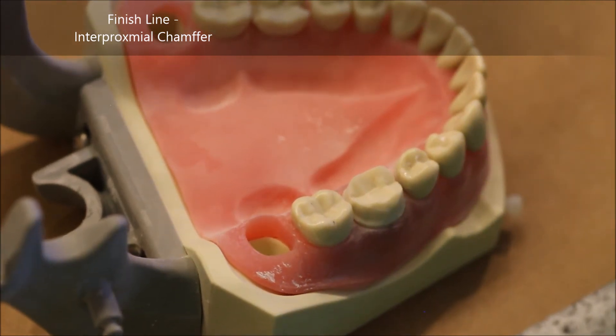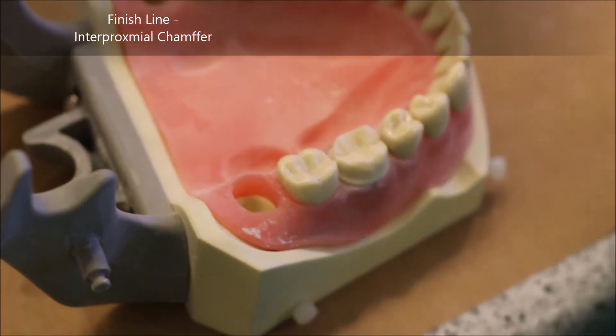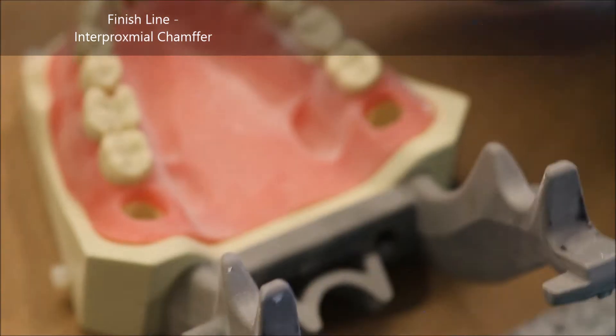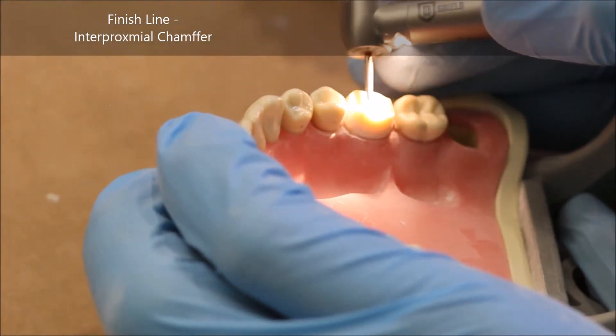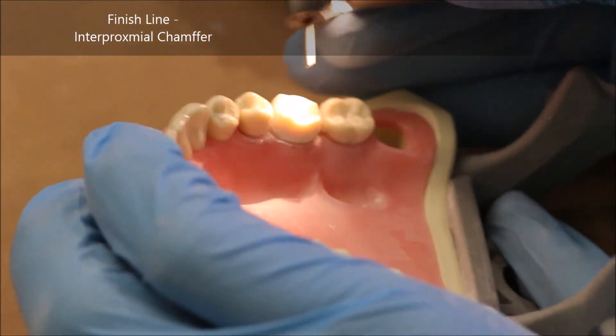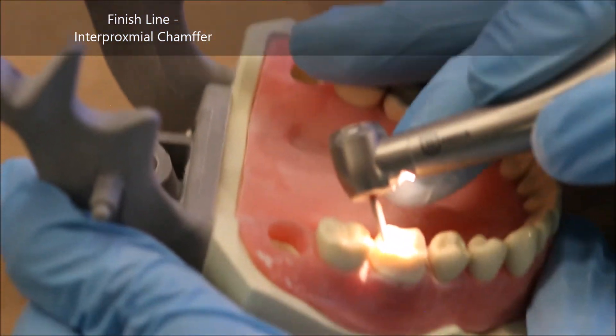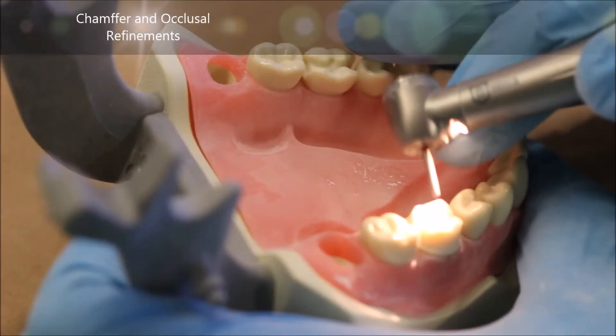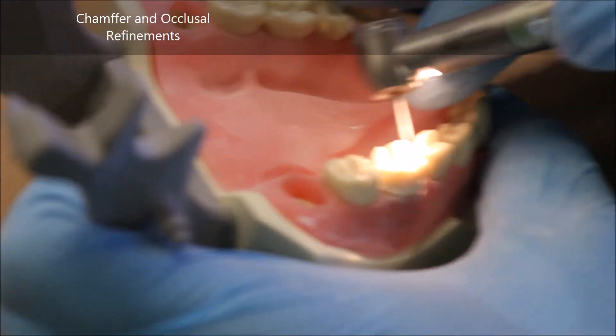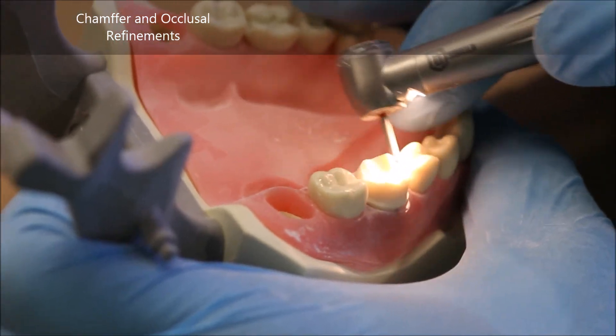It's crucial to remember that the finish line needs to be 0.5mm above the gingiva, but the gingiva isn't just a parallel arrangement of soft tissue — it goes up and down in various places, and your finish line must too. Once you've completed making your chamfer in the interproximal regions, I'm simply refining my prep.